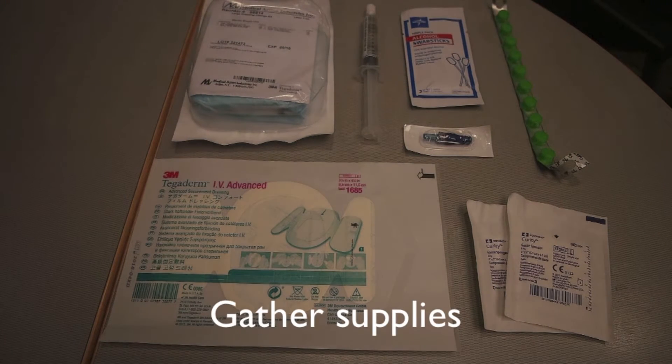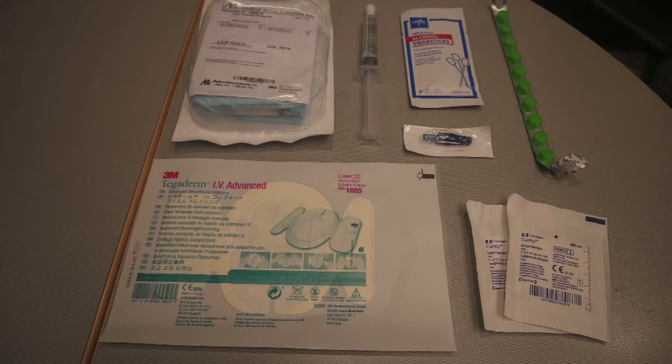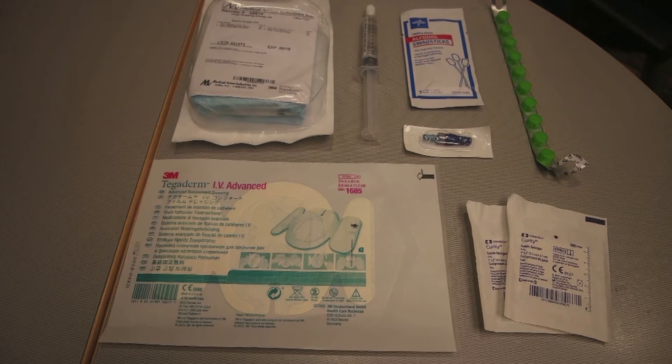We needed to get a sterile central line dressing kit, Tegaderm, normal saline syringe, CVC cap, Kuros caps, 2x2 gauze, and alcohol swabs.